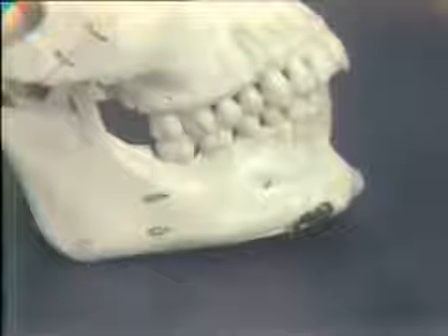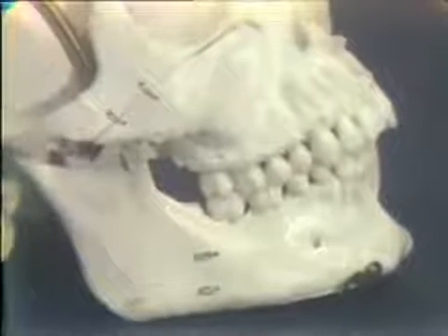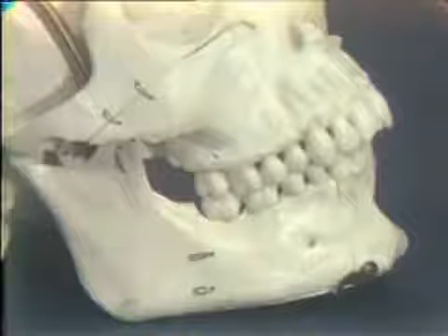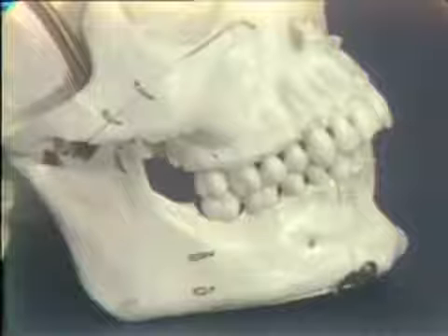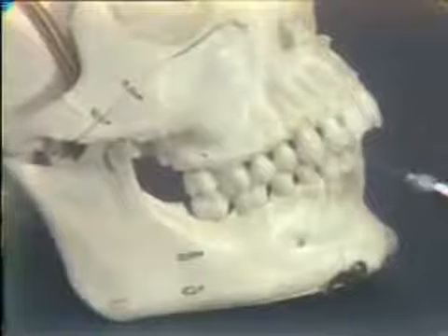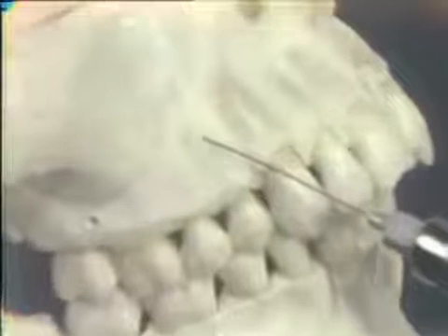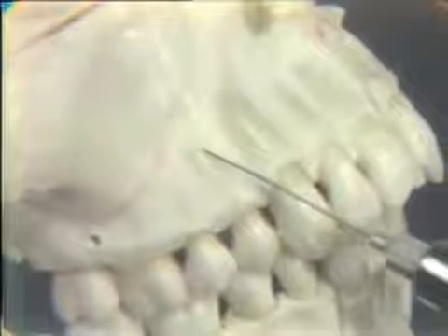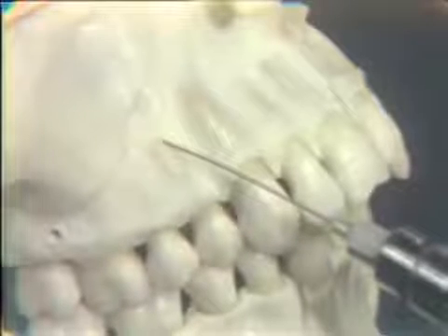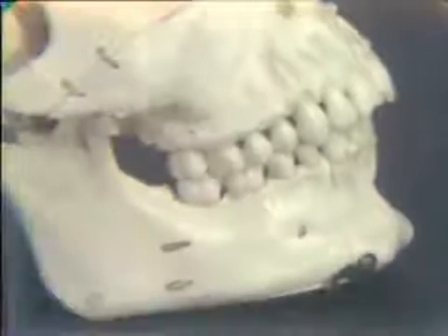The maxillary bicuspids are very simply infiltrated buccally, and remember again, we are anesthetizing the terminal branches of the middle superior alveolar nerve. Just as with the molar, with the mouth half closed, cheek retracted, and our needle bevel is directed towards the vestibule and quickly through the soft tissues, and then needle bevel engaging bone at a level of or slightly above the apex of the bicuspid, whether it be the first or the second bicuspid. All right, let's show that to you on the patient now.